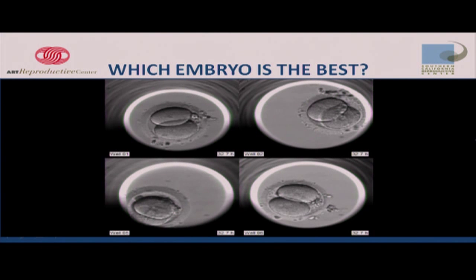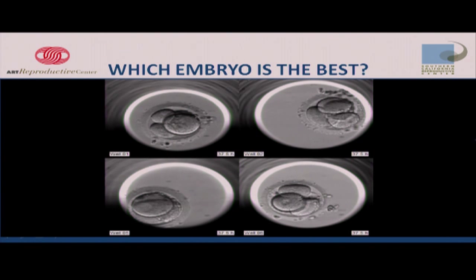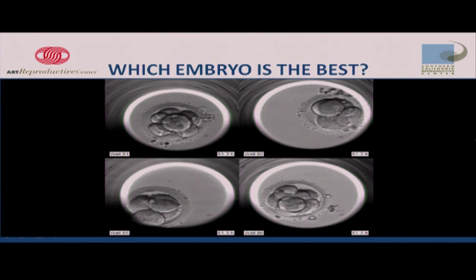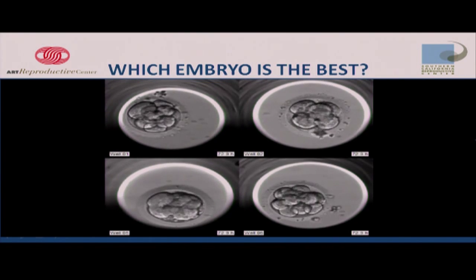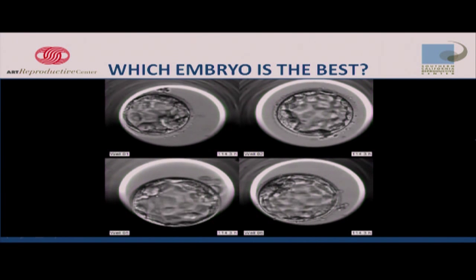We've gone along. There you actually see some multinucleation in the bottom right one when those 2 cells form. The one on the upper left is fastest. It's 4 cells already. The other ones were a little bit behind that. So it goes along. And then I'm going to speed up the video because I don't want to take forever with it. And you see them developing along some form of morula before the others. They keep all expanding. So everybody formed a blastocyst.